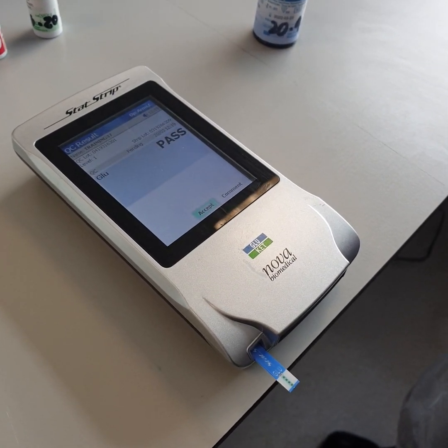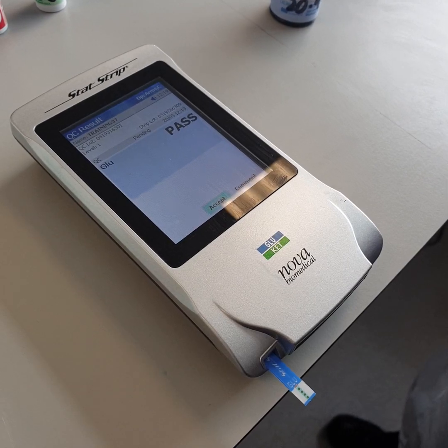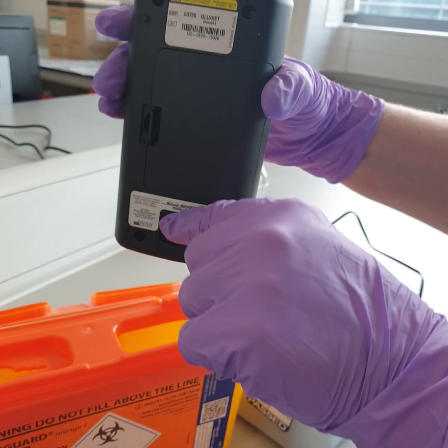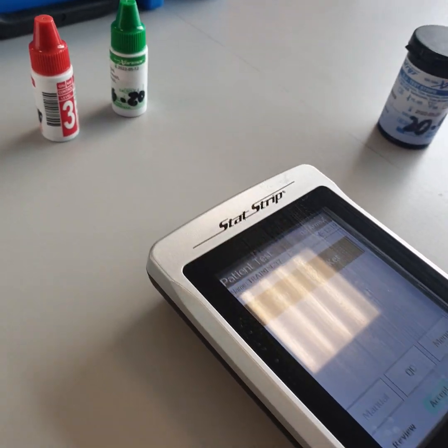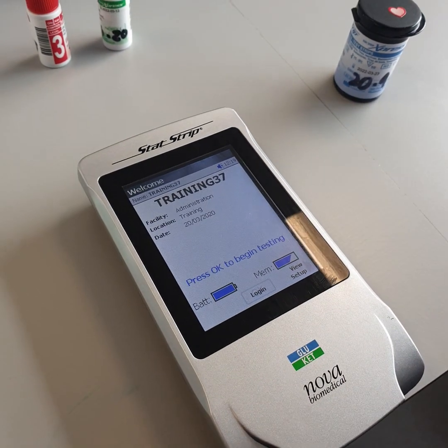If done correctly, the QC should pass. Accept the result, then eject the strip. Repeat the same process for Level 3 QC. At completion, click log out so that no one else can use the meter under your details.